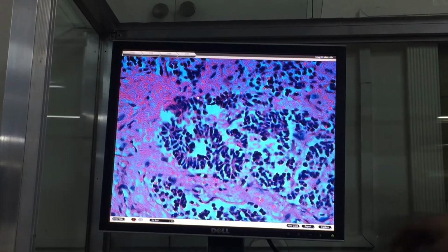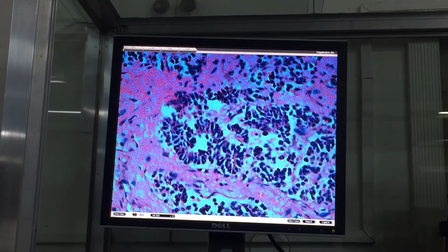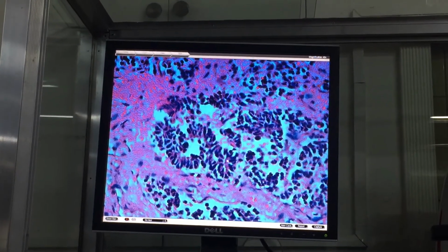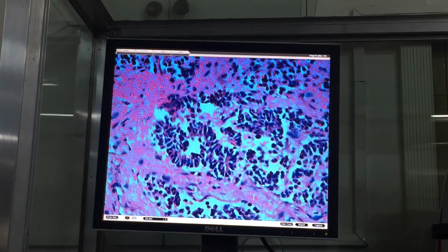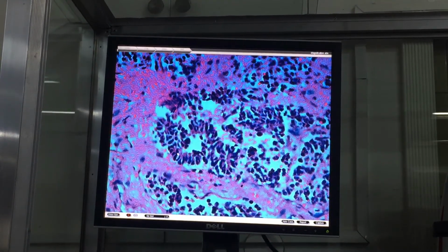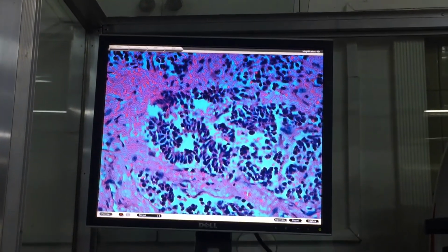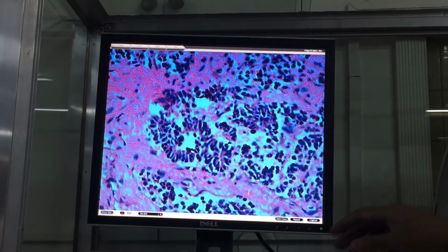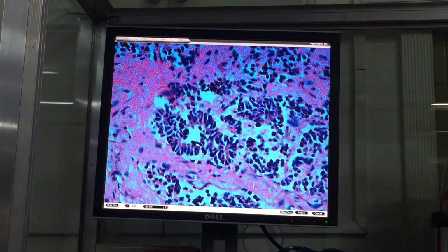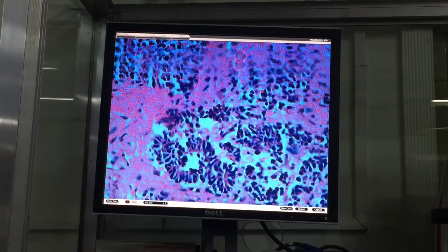I think these are your abortive epithelial cells. Before we've seen this one, like this one. You see, this is lined by epithelial cells. It is a gland. Also this one. These are the lumen of the gland and surrounded by epithelial cells here. This one has a pattern. You will see the pattern. It's going around. The cells are going around the lumen. The blastemal cells don't have any pattern. They just grow randomly. But this one you see glandular formation. If you see this, that's the epithelial cells.